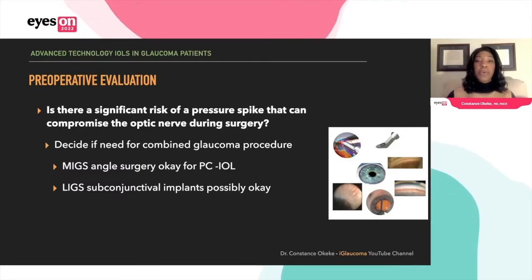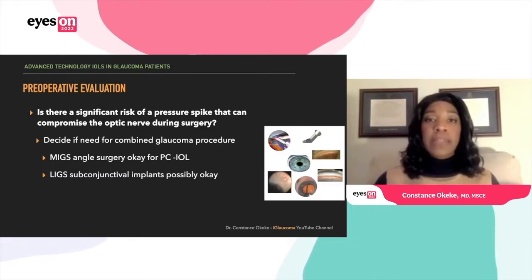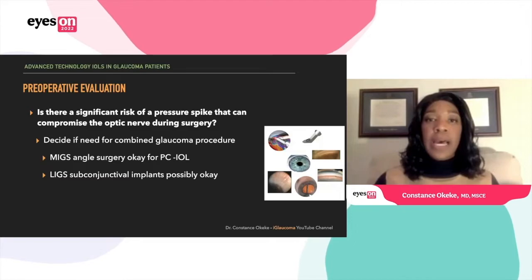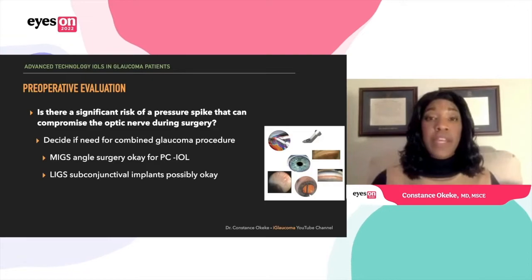And so you're talking about people who, let's say, had really high pressures, but their glaucoma wasn't so advanced and they needed a trabeculectomy to help control the pressure, but their nerves are still pretty stable, healthy, and their visual field damage is not a lot. They can have these type of lenses if they have a stable refraction, because you can correct the astigmatism at that point, and then give them also the extended range of vision if that's what they're desiring.